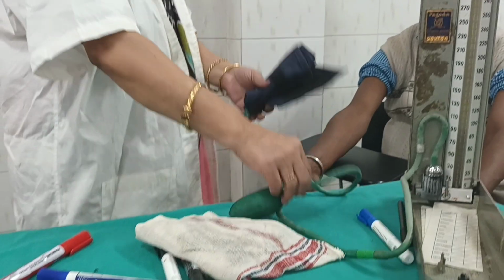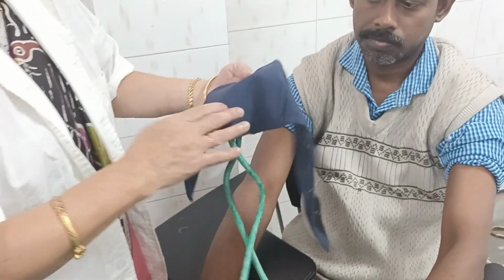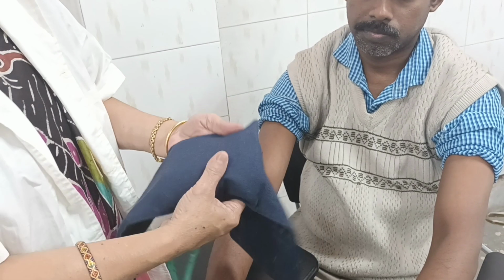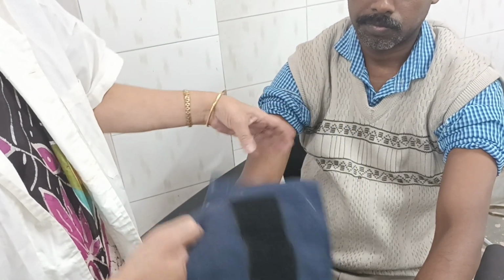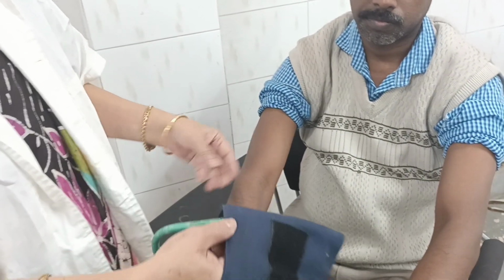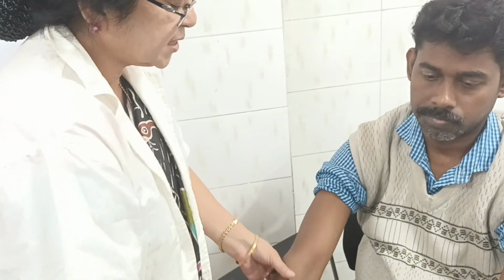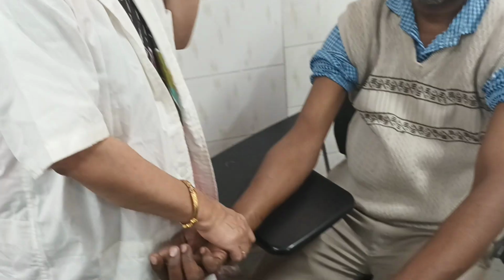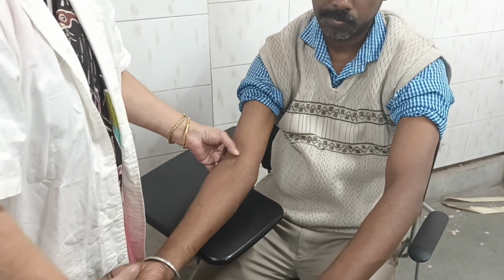Now, see, this portion is plain, so this should be in contact with the subject's arm, and this portion is velcro, so this should be above, and these two portions should be on both sides of the brachial artery. Before placing this cuff over the arm, first find where you are hearing all the Korotkoff sounds, over the brachial artery. So you have to feel the brachial artery first.